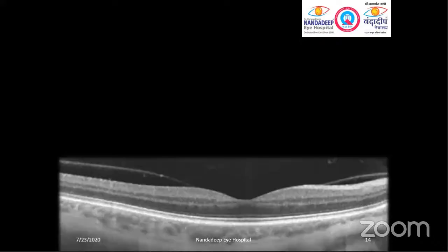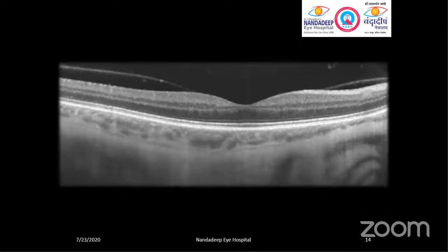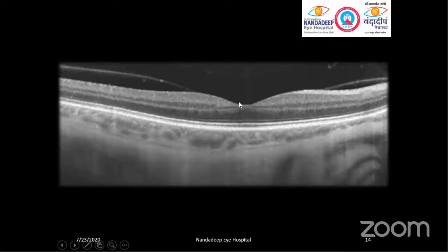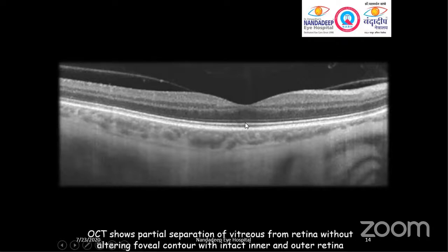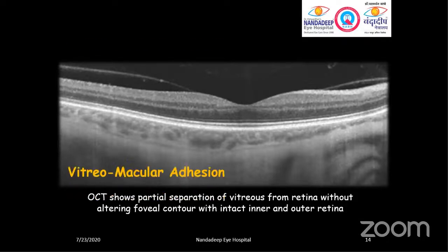Let's see this OCT report. Here we see that in the vitreo-retinal interface area, there is a hyperreflective membrane. But the foveal contour appears to be absolutely normal — there is no alteration of the foveal contour. At the same time, the inner retinal layer and the outer retina are intact. The report would read: partial separation of vitreous from retina without altering foveal contour, with intact inner and outer retina. If you see this kind of case, it may be a possibility of vitreo-macular adhesion.